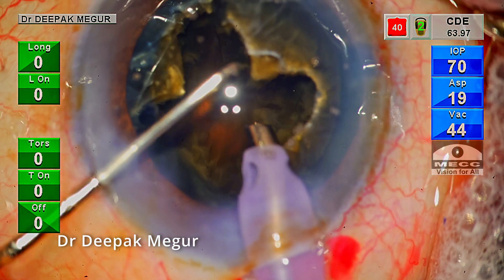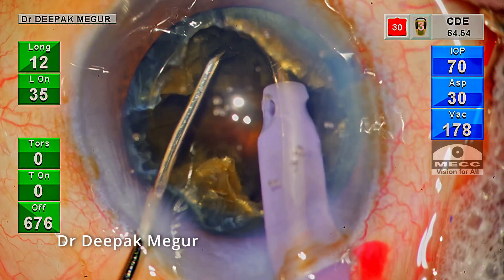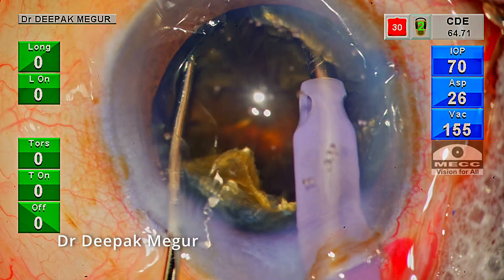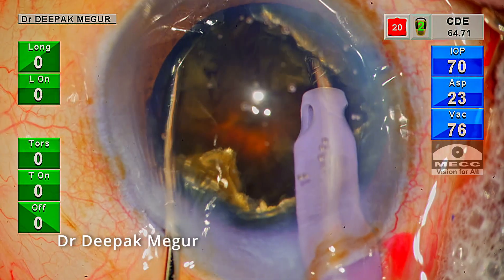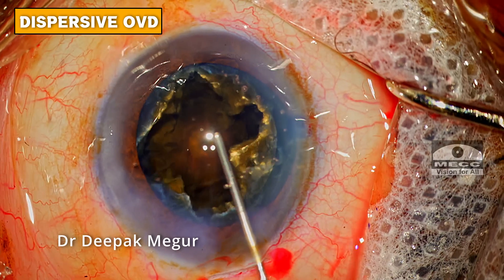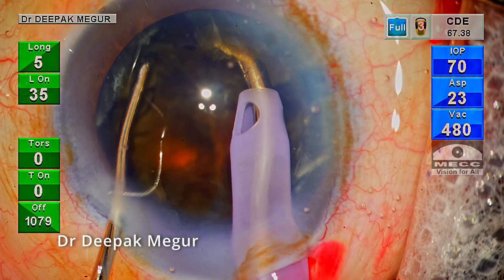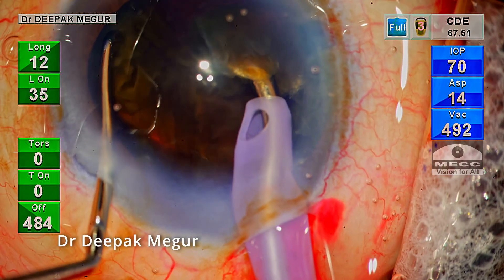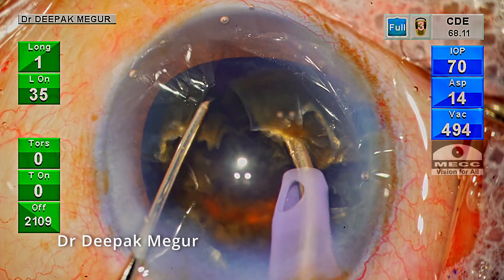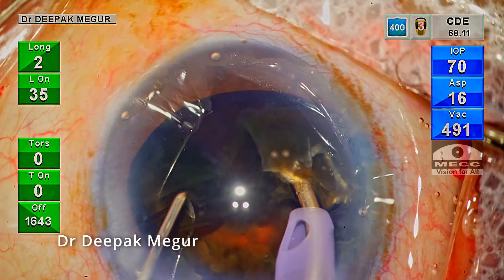Luckily, the first fragment separates quite easily. The nucleus is rotated again and lateral separation is begun on the next fragment — it's quite tough. The trench was probably not deep enough. I go back to refill the anterior chamber and bag with OVD: dispersive OVD below the cornea and HPMC within the bag. I occlude the fragment with the tip, lift it up a little, and then the chopper is placed at progressively deeper planes to perform the lateral separation. It was really tough, but finally the fragments were separated.